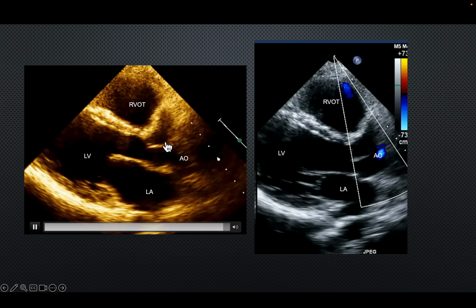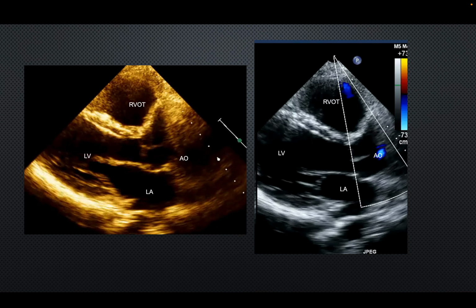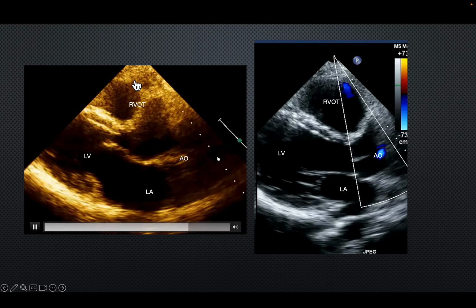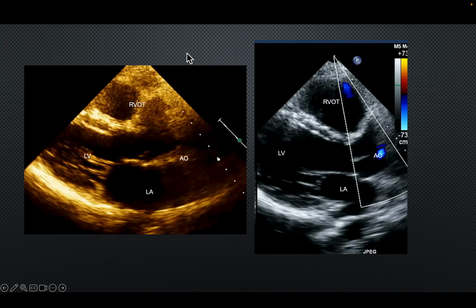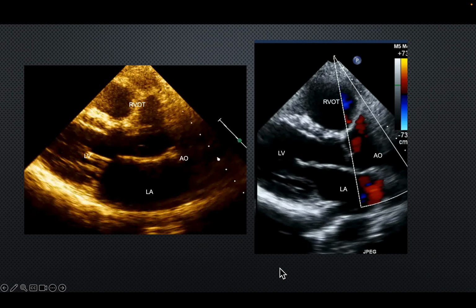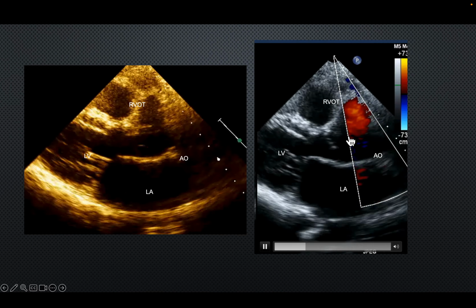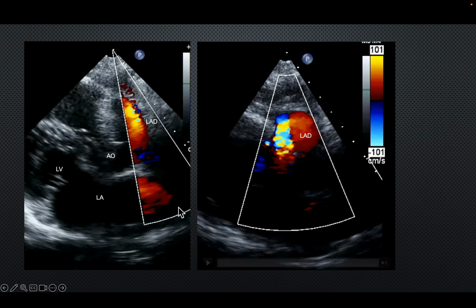At first we thought this was the right coronary artery. Honestly, we reported this as a dilated right coronary artery creating a fistula, but on an angiogram, I would show you that angio, it was the left coronary artery. So where did we mess up? On retrospectively reviewing the case, we saw that the flow is not coming from here, it's coming somewhere else. I show you on the next slide.